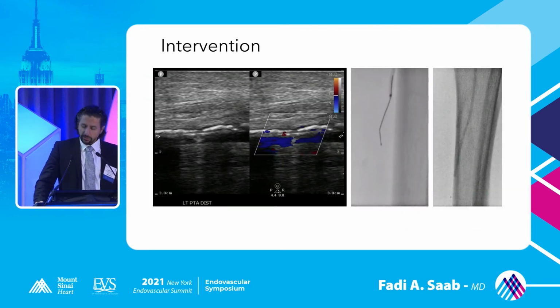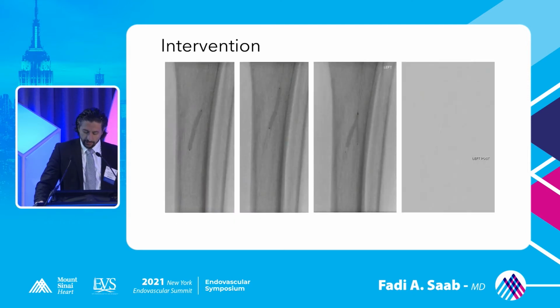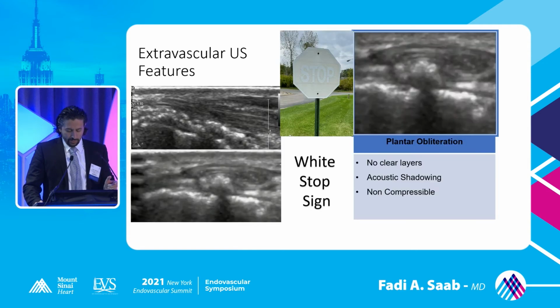This is an end-stage plantar disease patient that is going to end up with an AV reversal. So we end up treating the arterial side, excuse me, for this patient. We treat the PT takeoff for this patient, and we do actually kissing balloon angioplasty here. We prepare this patient for AV reversal. This was a staged intervention. And let me show you ultrasound-guided AV reversal.